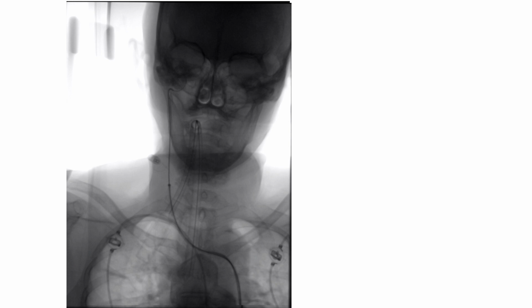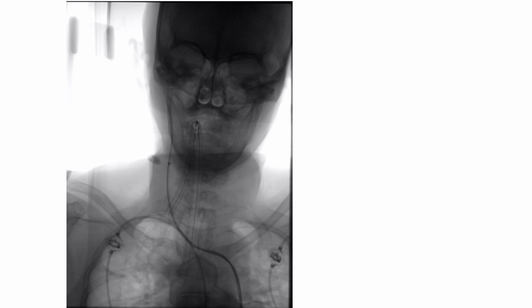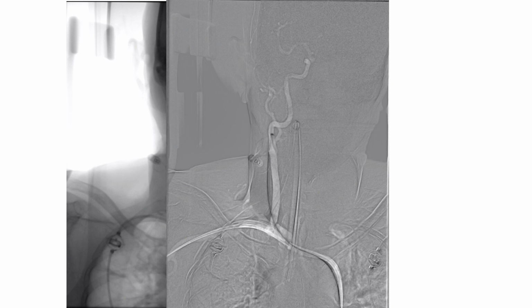Technically not at all challenging, provided you understand this concept of keeping a wire distally anchored, then taking the catheter and then taking the wire into the target vessel. And then after you're secured with the diagnostic catheter, exchange it for an extra stiff wire. Now the extra stiff wire is there, you've got a catheter there, pull out the catheter from the subclavian, push your sheath up, and you are in target position. We have used it n number of times, it has always worked, never has there been a problem. So you can see how we are taking the long sheath higher.